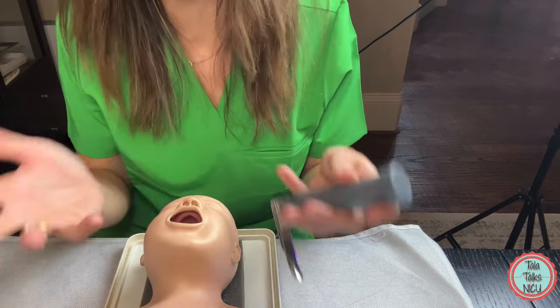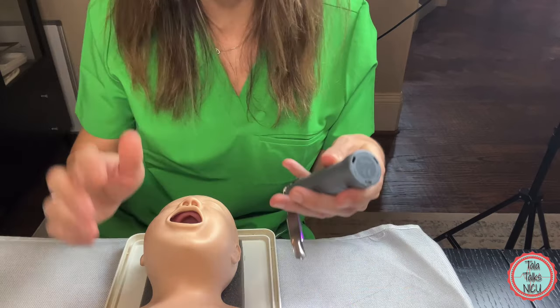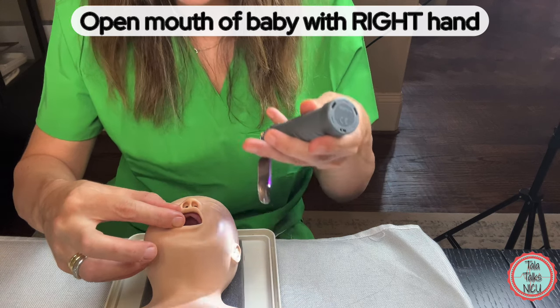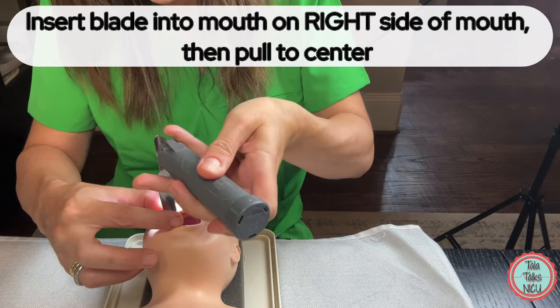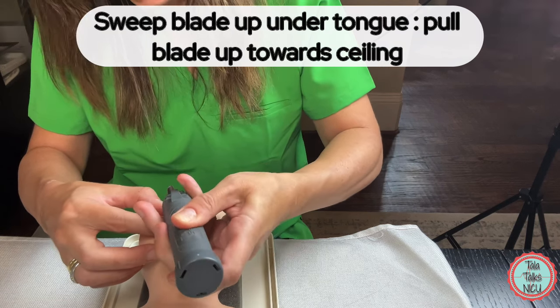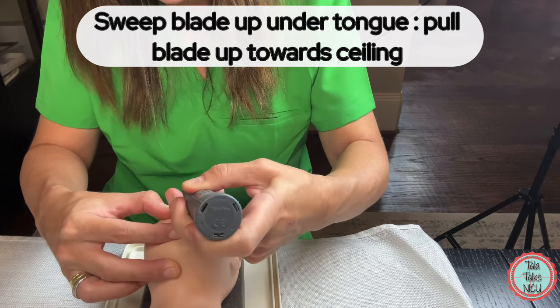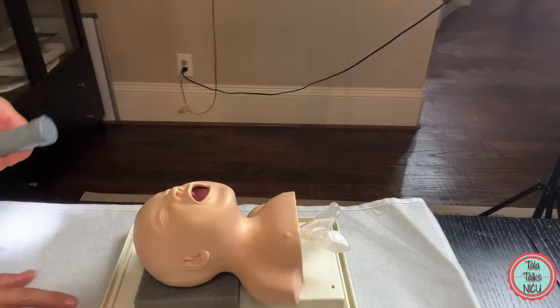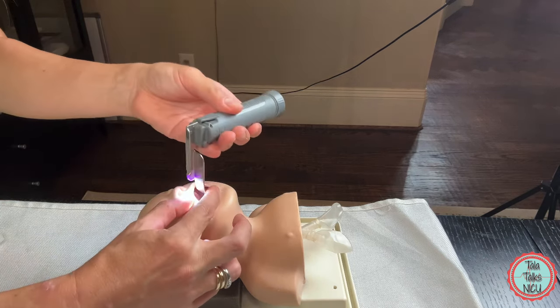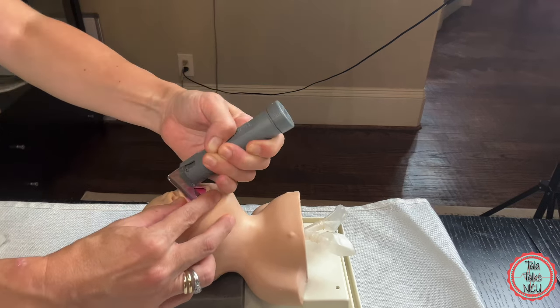Let's go through the actual intubation — you should be wearing gloves for this, but I'm not so you can see more clearly. You've got your blade in your left hand. The first thing you do is open the mouth of the baby with your right hand. Then you put the blade starting on the right side of the mouth, sweep it up under the tongue, and start pushing the blade up towards the ceiling.